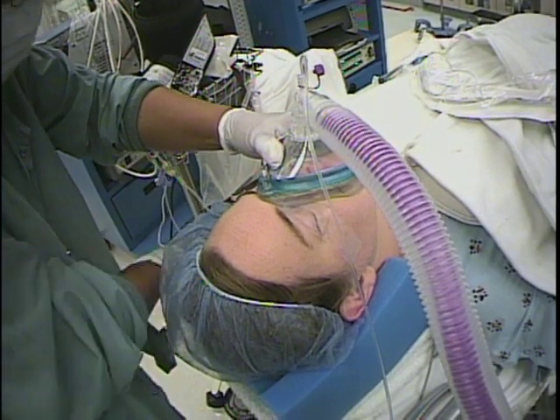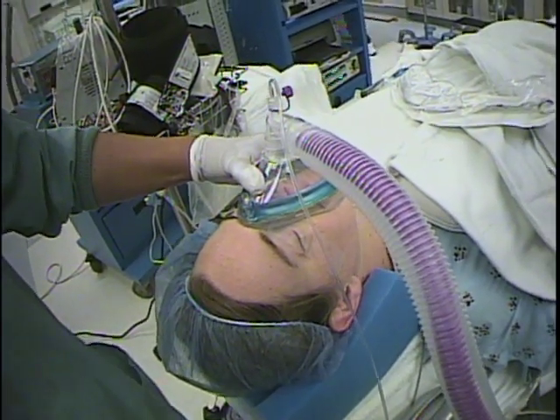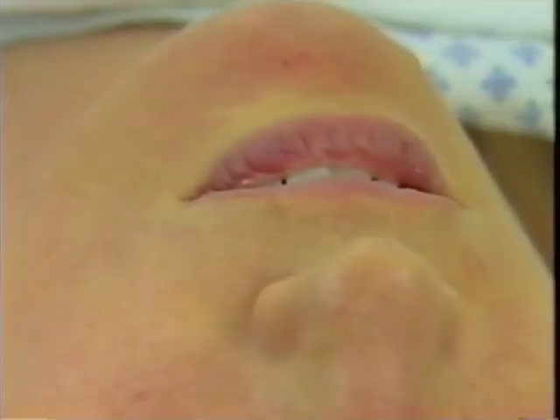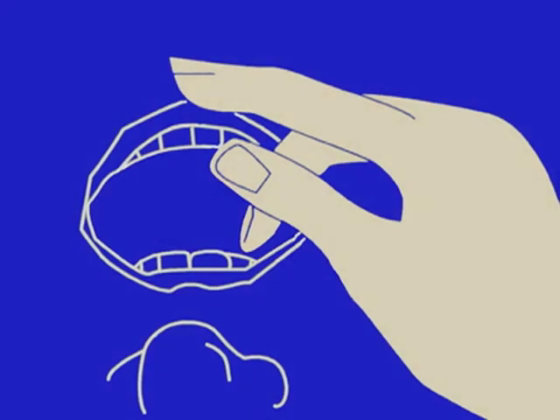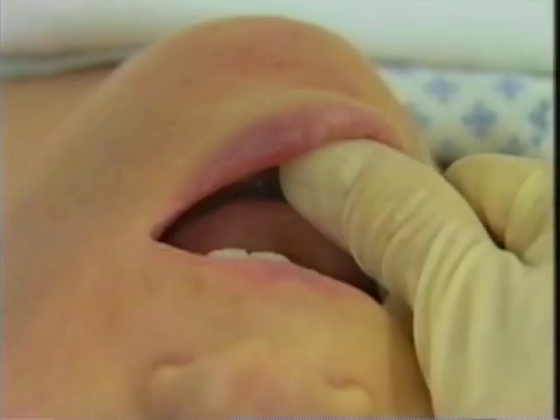If you're using a stylet, this should already be in the tube and bent as desired. Tilt the head into extension and stabilize it. Open the mouth using your right hand as far to the right side of the mouth as possible. Your thumb is on the lower teeth, and your middle or index finger is on the upper teeth. This position is similar to snapping your fingers. By pushing rather than spreading, you can open the mouth wider and more forcefully.